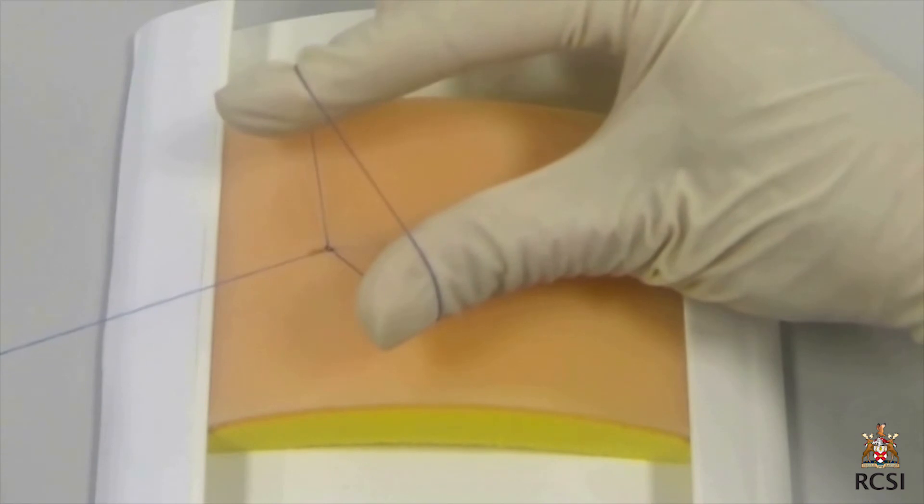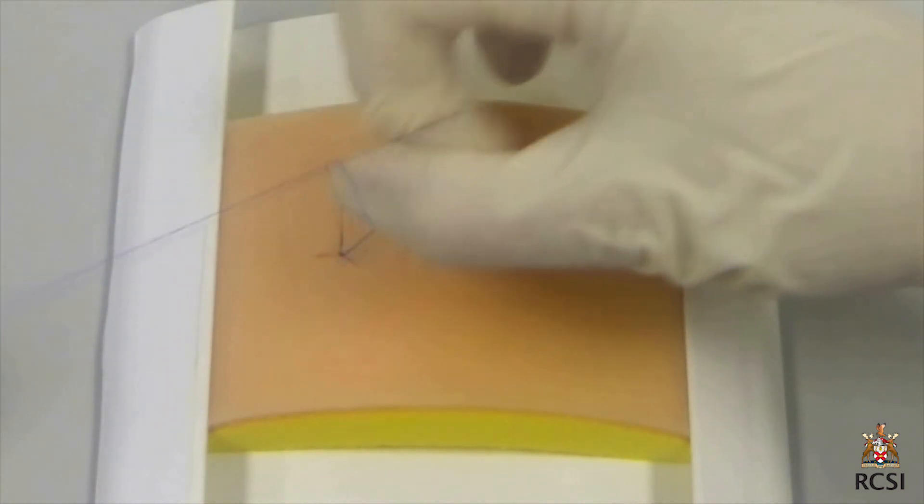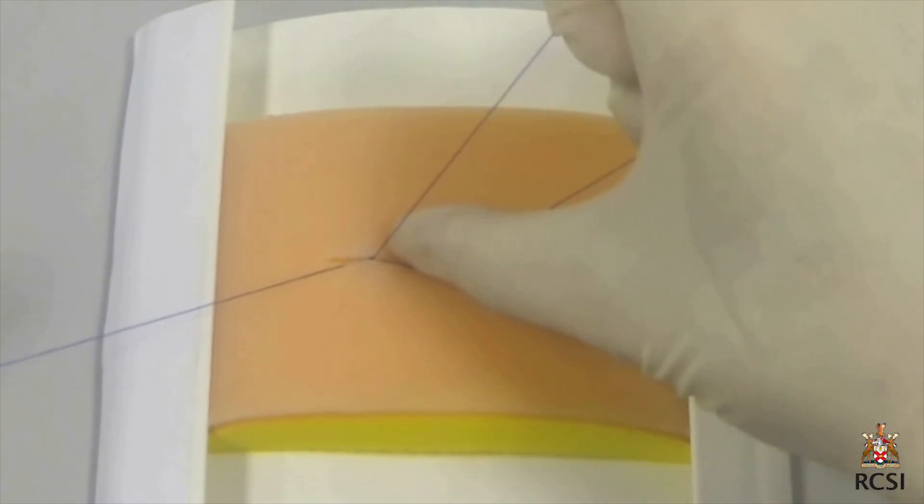Then the process is repeated, pulling another loop of suture material through the new loop while all the time holding the long end with the left hand. You will find that pulling more on the lower end of the loop with the right hand will help tighten it.